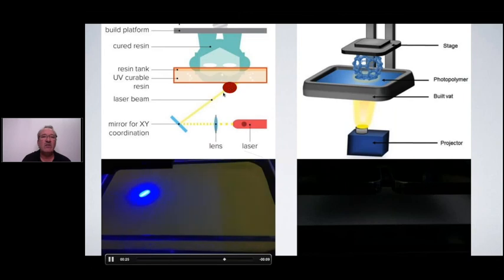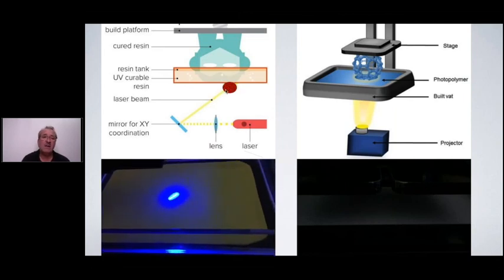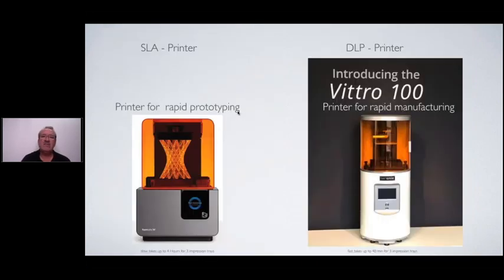And the accuracy is not so good because the point of the laser is 140 microns. On most of them, like on the Formlabs, it's 140. So for XY accuracy, I don't think we will get better than 150 microns. That's why these are good for prototyping, but not for manufacturing. For your idea, it takes us about 40 minutes to manufacture 3 custom impression trays.